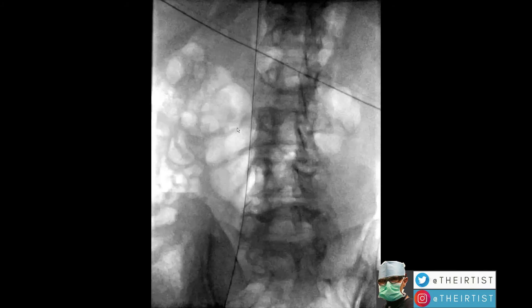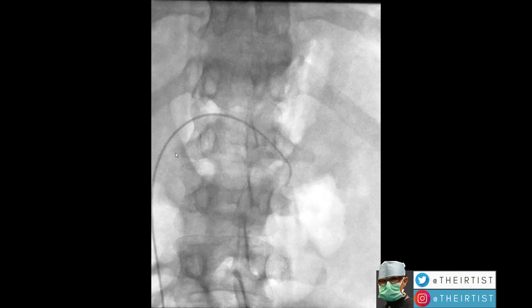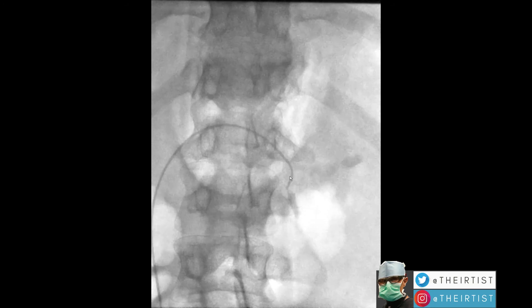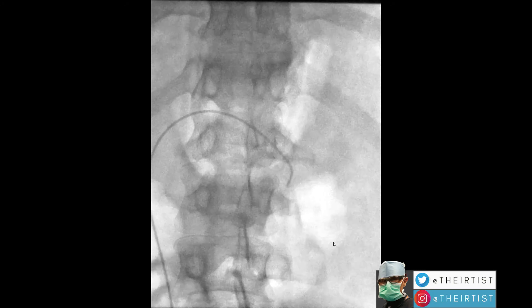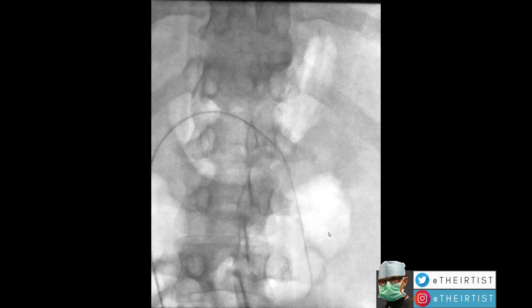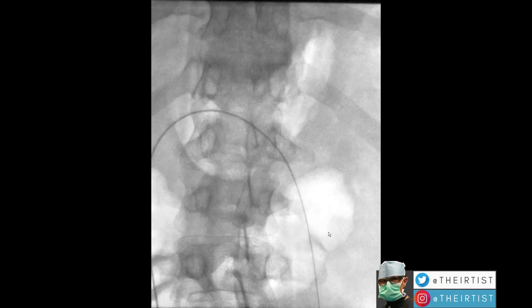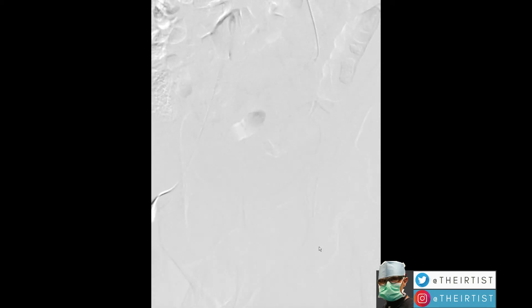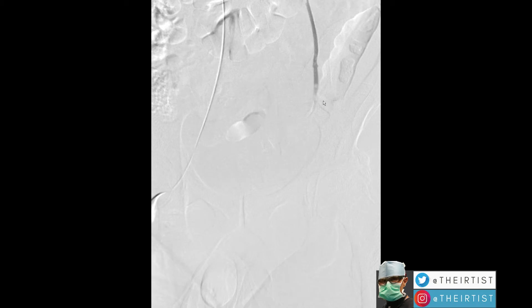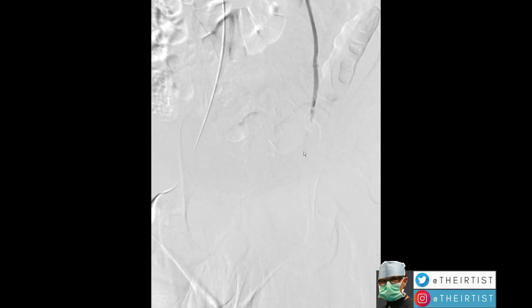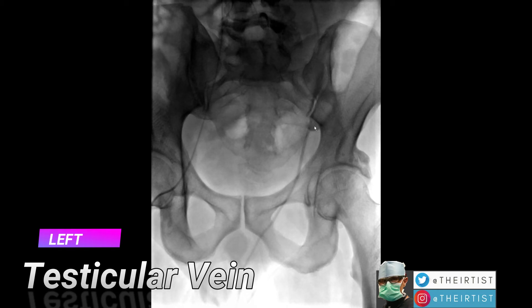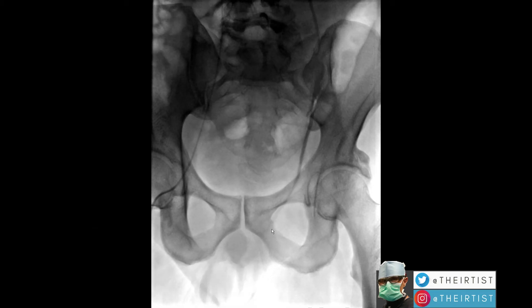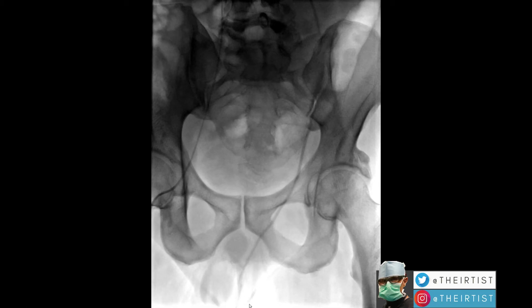We insert a small guide wire that goes into the vein. Here we enter the left renal vein and quickly find the left gonadal vein, or left spermatic vein. From there, we advance our catheter and obtain selective catheterization. We do what we call a venogram, which is a study of the gonadal or spermatic vein by injecting contrast. This allows us to visualize the reflux of blood all the way to the left testicle of the patient.